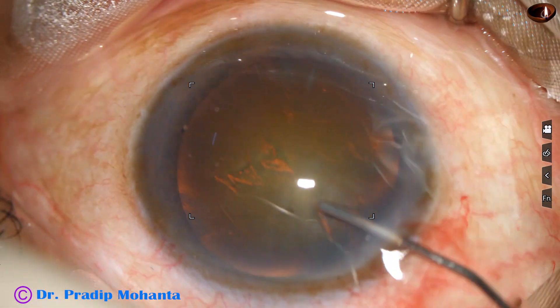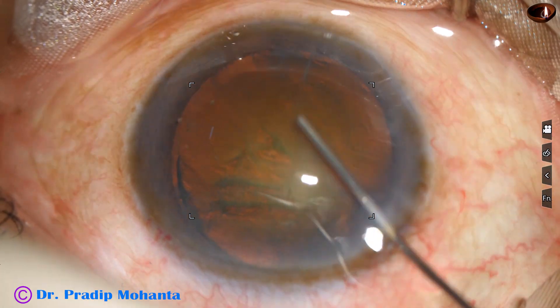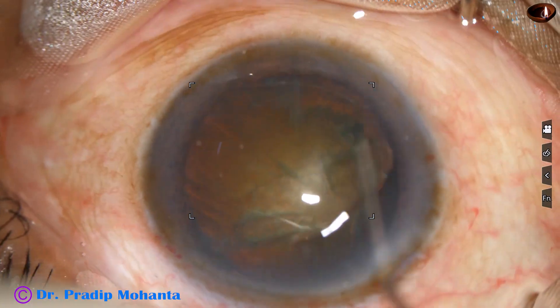Hydrodissection is done with a 27 gauge cannula and BSS. The nucleus is rotated.